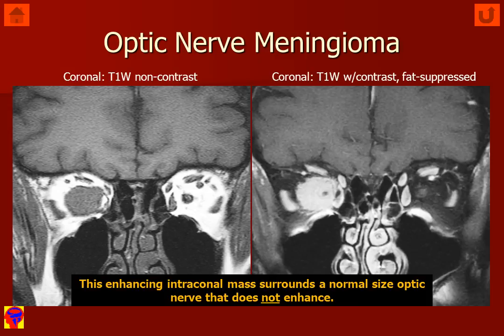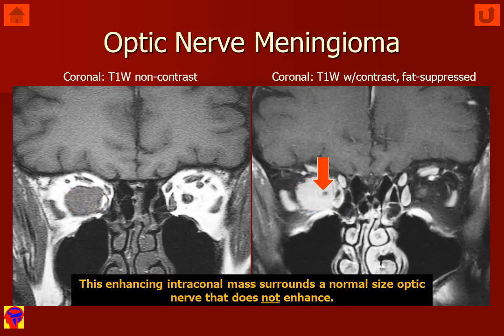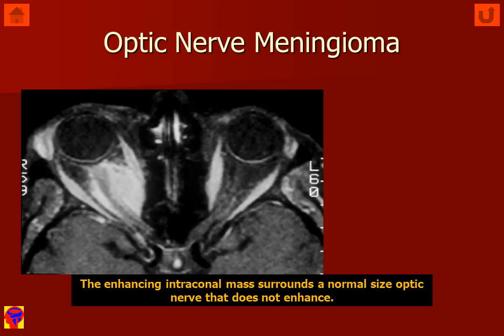On the non-contrast image in the coronal plane, we see an intraconal mass. If we look at the enhanced image, looking carefully in the center of the enhancing lesion, we can see a non-enhancing rounded structure, which is the normal optic nerve. In the patient's left orbit, we can see a non-enhancing optic nerve in the green circle. So this enhancing intraconal mass surrounds a normal-sized optic nerve that does not show contrast enhancement.